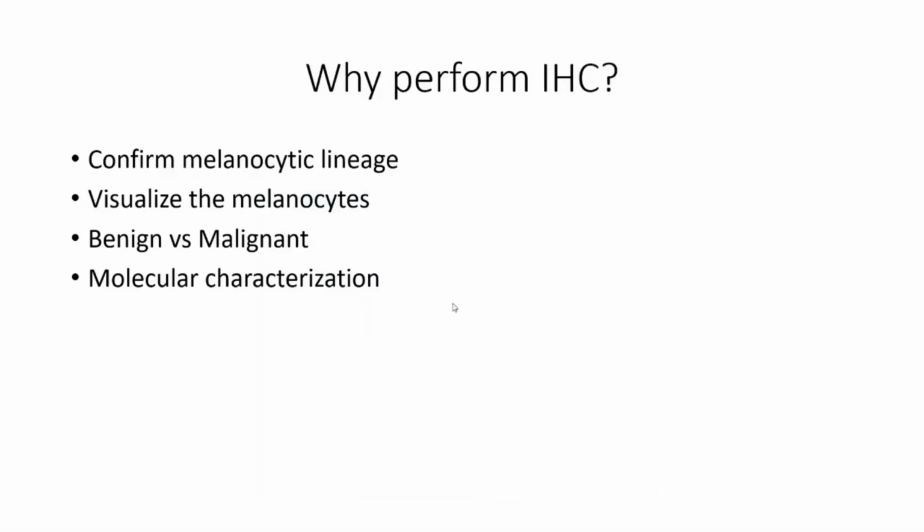So why perform IHC? We will see this in more detail in future videos. There are 4 reasons: to confirm melanocytic lineage, to visualize the melanocytes, to try to assess benign and malignant cases, and lastly, to perform molecular characterization.